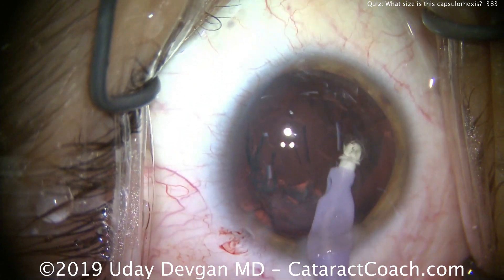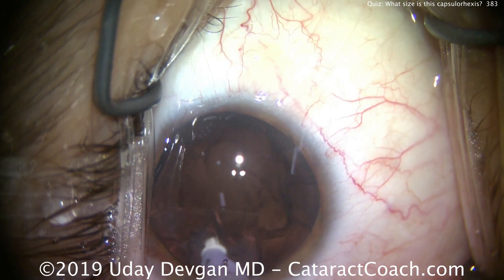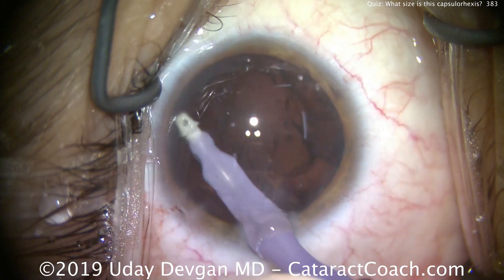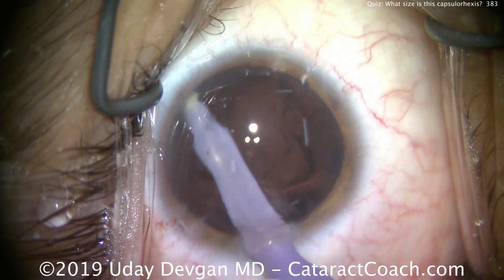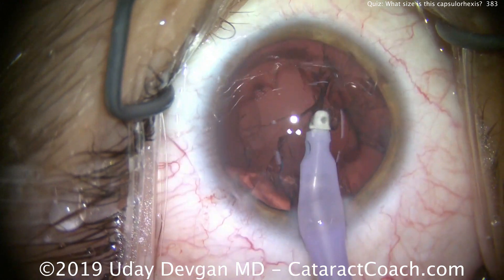As we finish aspirating, we'll see the capsulorhexis margin pretty clearly. Again — tell me, is this rhexis going to be too small, too big, or just right? We're cleaning up all the lens material.